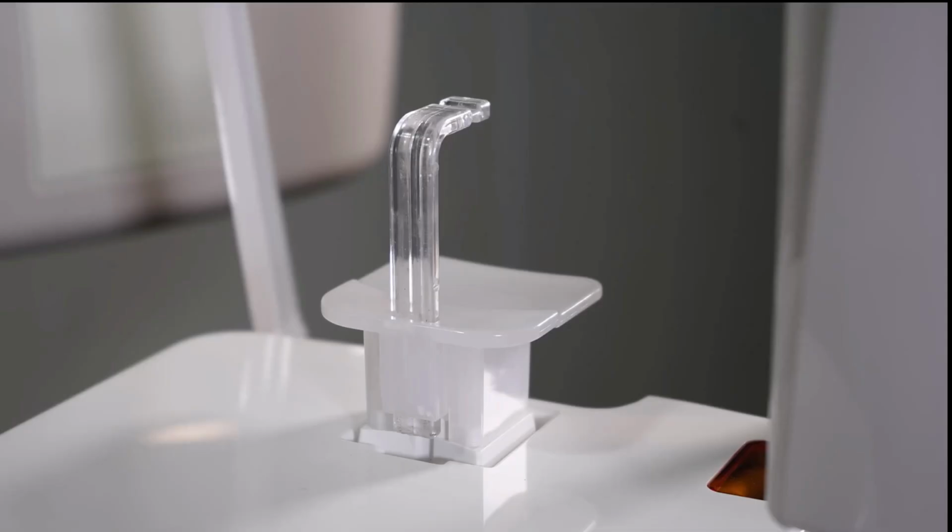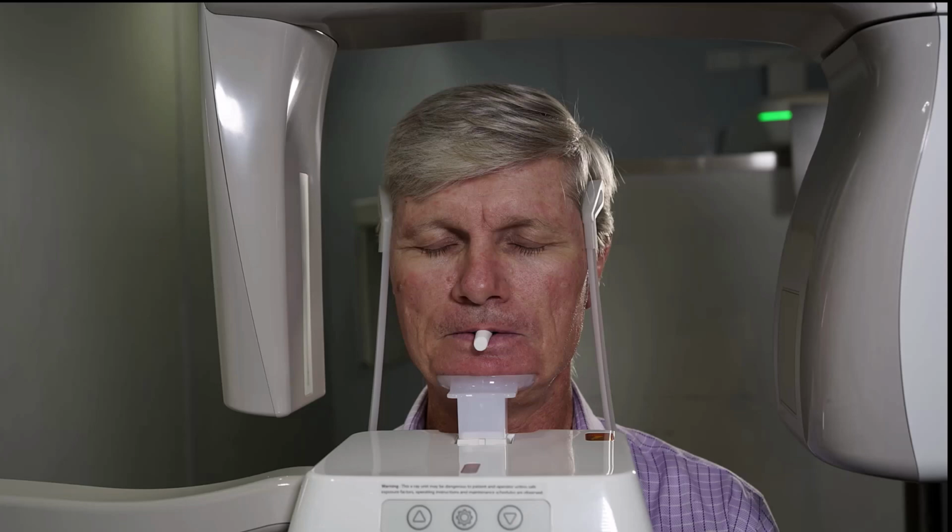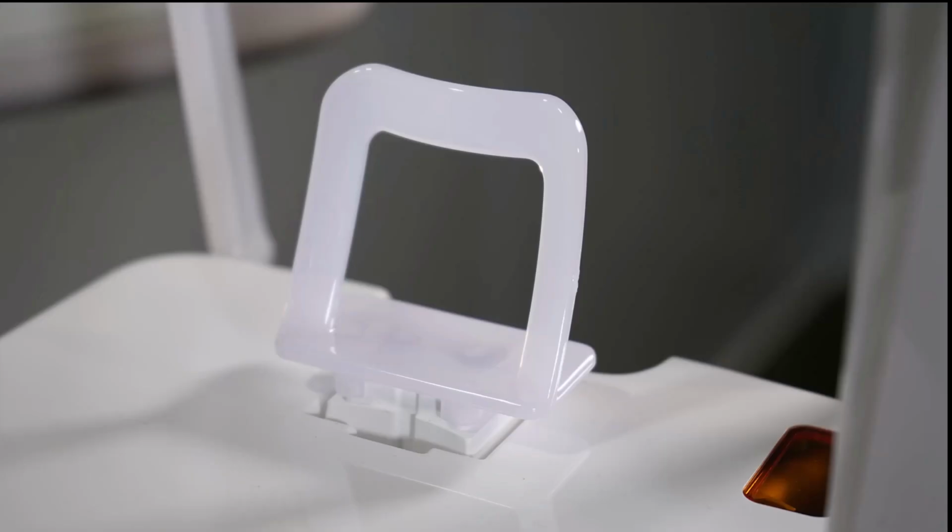Chin support with normal bite block. Chin support with edentulous rest. Note, use a cotton roll to separate the bite. Sinus rest / TMJ rest.